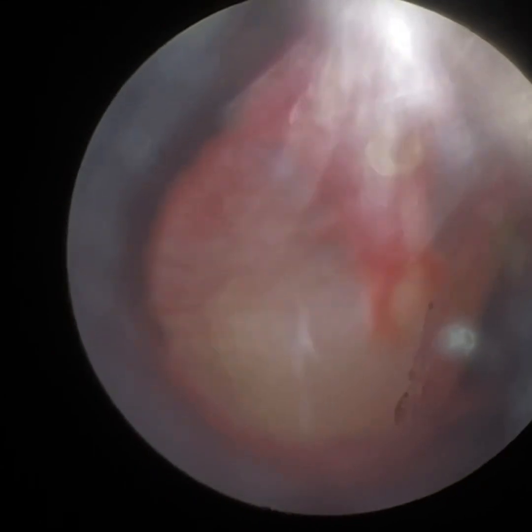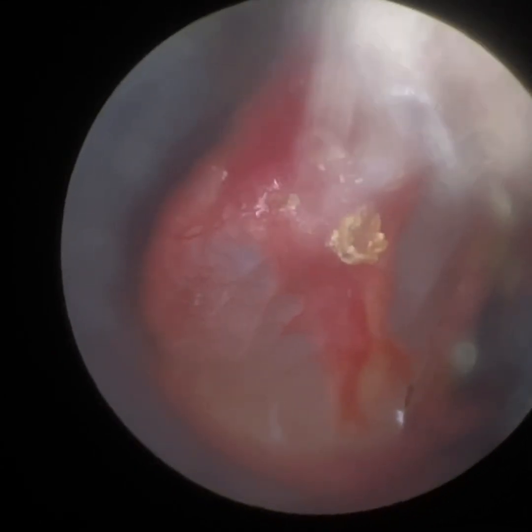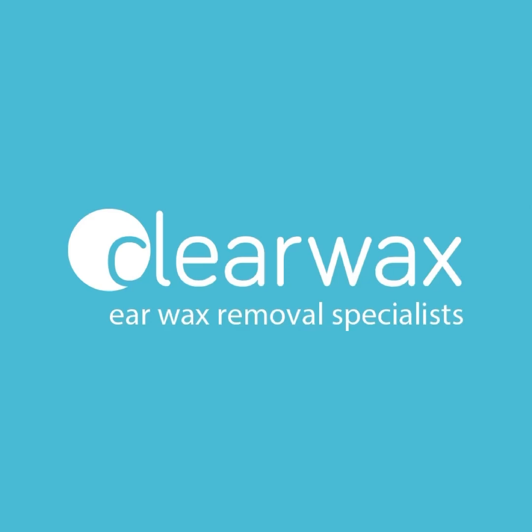The eardrum is intact, slightly vascularised — that's presumably because the wax was impacted right up against the eardrum — and there's a slight retraction, but otherwise nice and healthy. Happy client. You can see that big lump of wax to the left — just how huge it is — and there's an earhook in the midst of it all as a comparison to give some perspective.